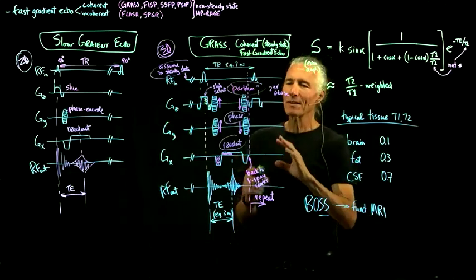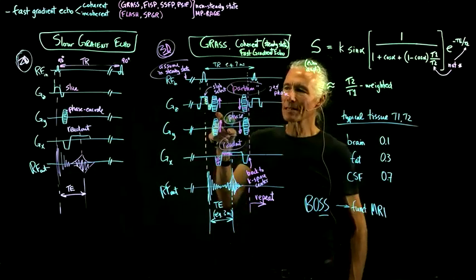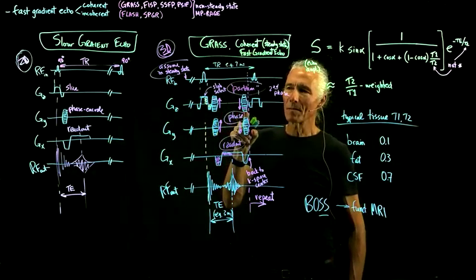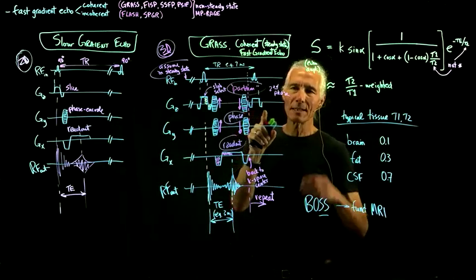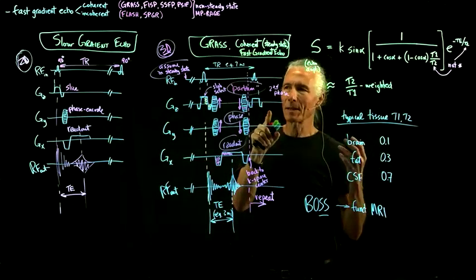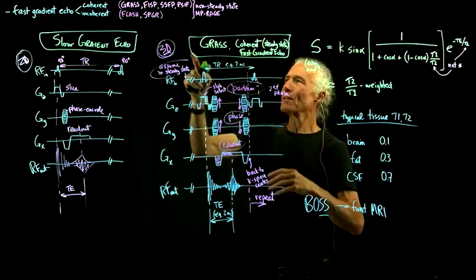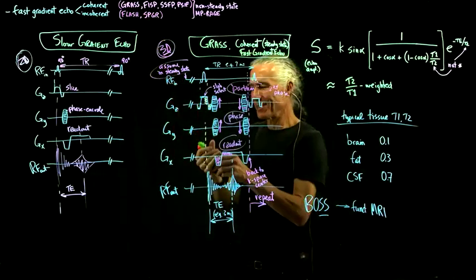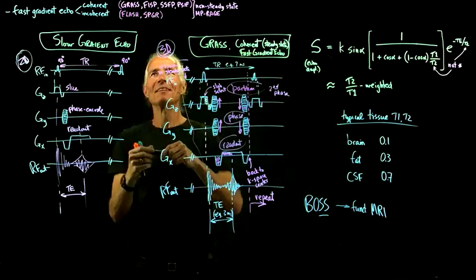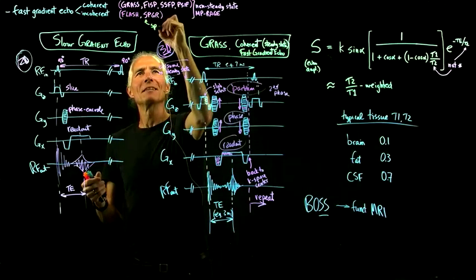So what are the issues about a sequence like this? Well, when you're doing this and patching up the magnetization, little imperfections in the gradients can lead to various kinds of artifacts, because with our standard MRI, a lot of times we just try to spoil, spoiled grass. What does that mean?